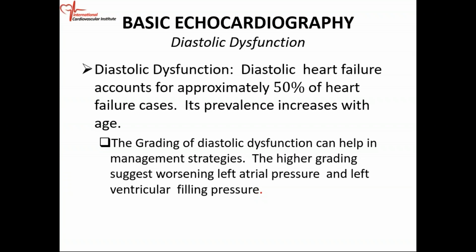that determine the diastolic function. And we can look at other things such as the mitral annular velocity, tissue Doppler imaging, or tissue Doppler velocities. And we talk about the base of the heart when the heart contracts. The base of the heart is where the mitral valve inserts into the heart. So that's the base, and the base moves up towards the apex in systole, and then in diastole it moves downwards.